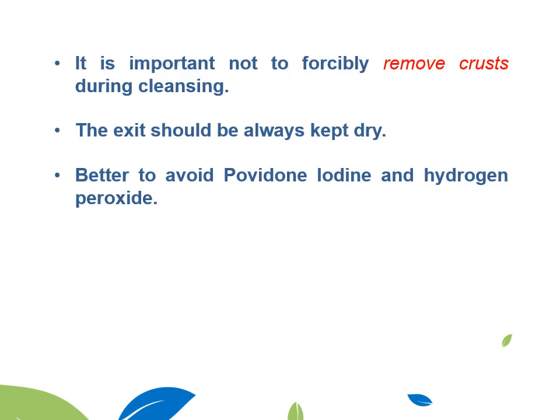However, it's important to remember not to forcibly remove any crust during cleansing, and the exit site should always be kept dry. So try to avoid using any ointments. Try to keep it always dry, and it is better to also avoid povidone iodine or hydrogen peroxide in cleaning the exit site, because povidone iodine and hydrogen peroxide sometimes react with the catheter material itself, and it may lead to some erosions in the long term.